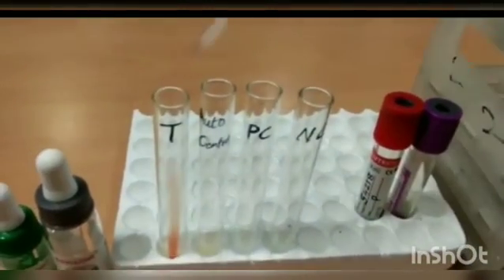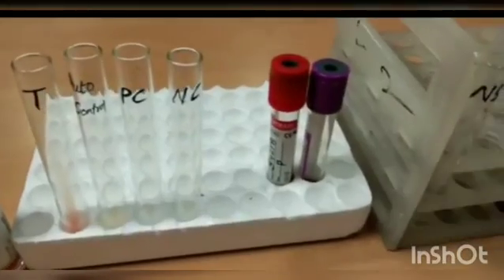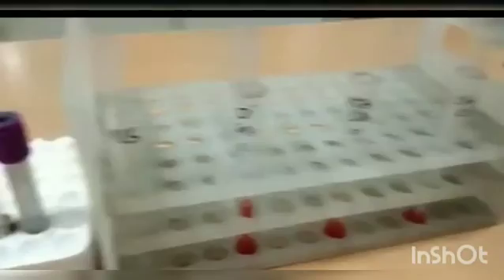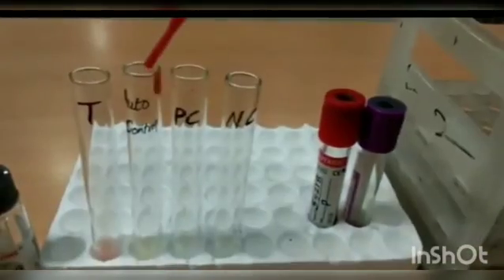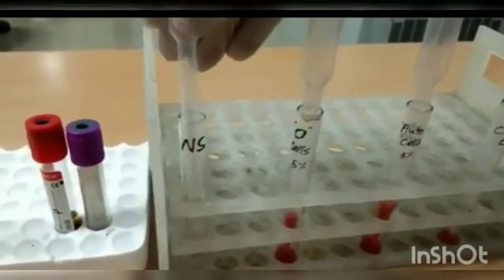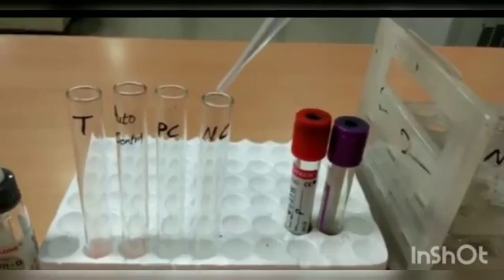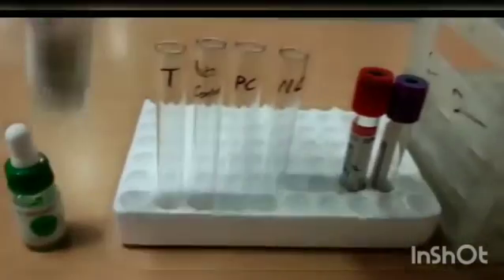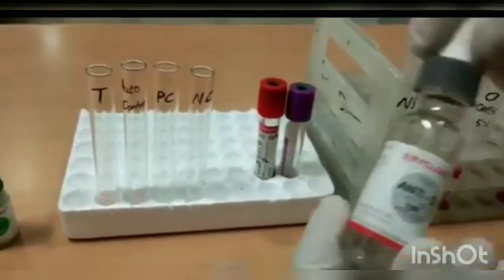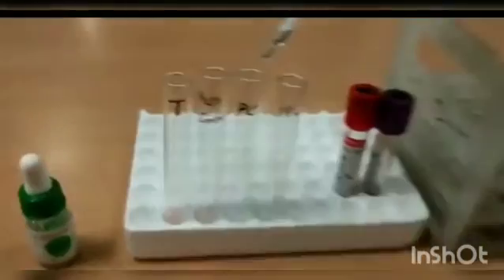Take the auto cells to the auto control. These are all pooled cells, and then add normal saline to the negative control, and then anti-D reagent to the positive control.